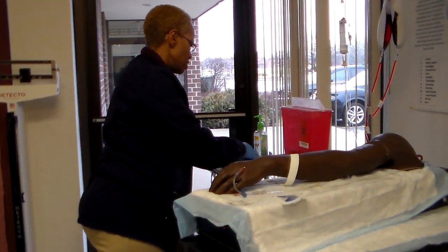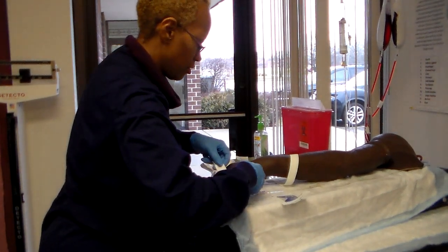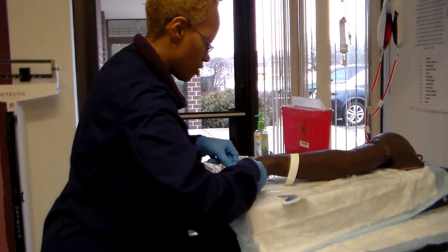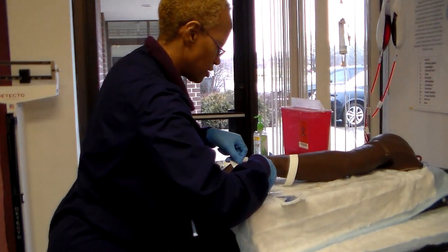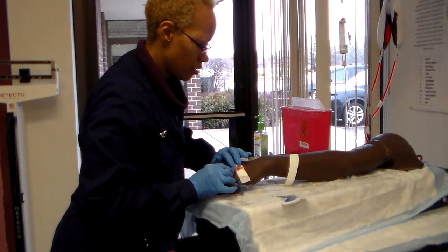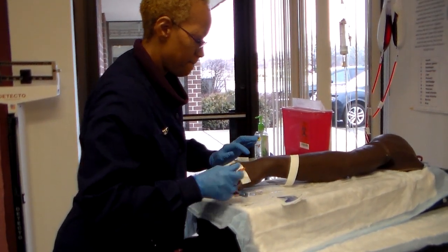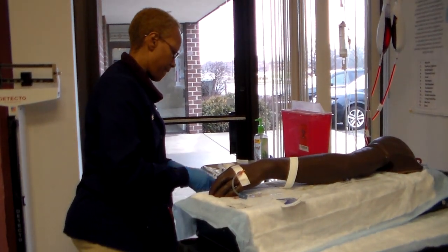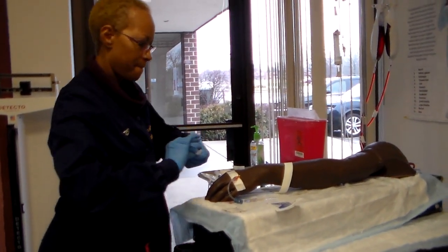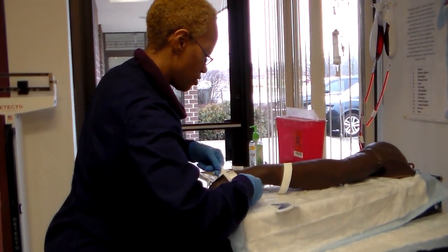Now you're ready to secure your IV. I'm going to protect right under the hub. Add on an anchor.